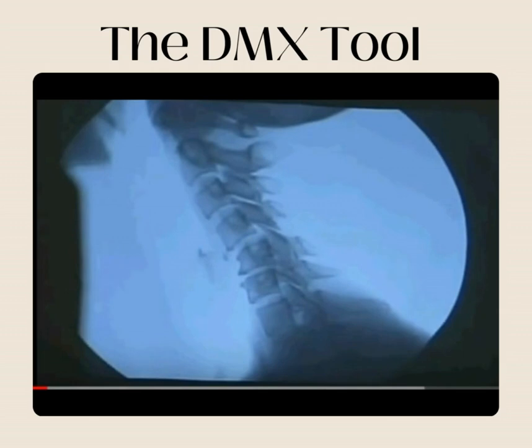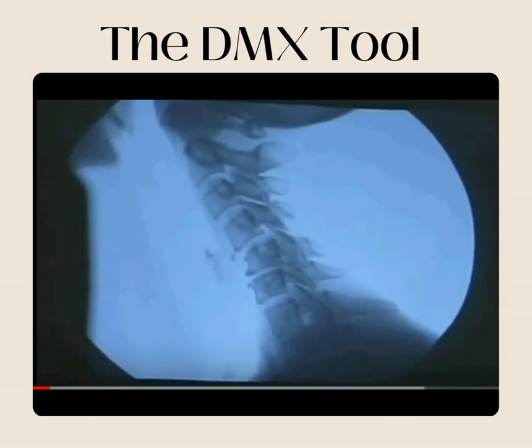Let me freeze this. This lady came to me and says, no one can figure out what's wrong. I go, I'm no rocket scientist, but just tell me when it hurts. She goes, well, every time I bring my chin to my chest and I look up is when I feel the most pain. I said, well, go ahead and move. So right away we can follow the George's line or backside of these bones up, and we have a stair stepping here. That is a torn posterior longitudinal ligament here.